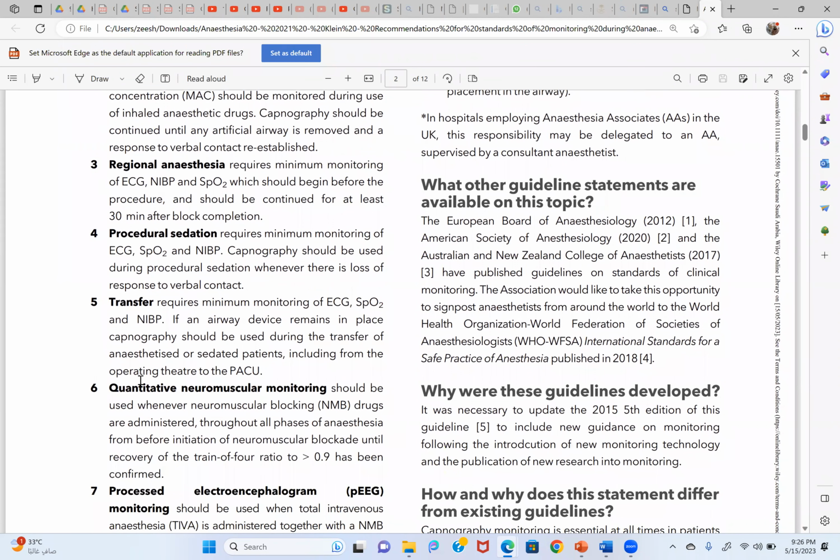Okay. Then we did not touch on neuromuscular monitoring. Neuromuscular monitoring is needed especially in cases in which anything can prolong the effect. Number one, this will be one reason. The other reason is that you don't want the patient to move. So those are usually the two indications in which you need strict neuromuscular monitoring, for example, eye surgery or any delicate surgery in which you don't want the patient to move. So in that case, you will be monitoring the neuromuscular blockade.